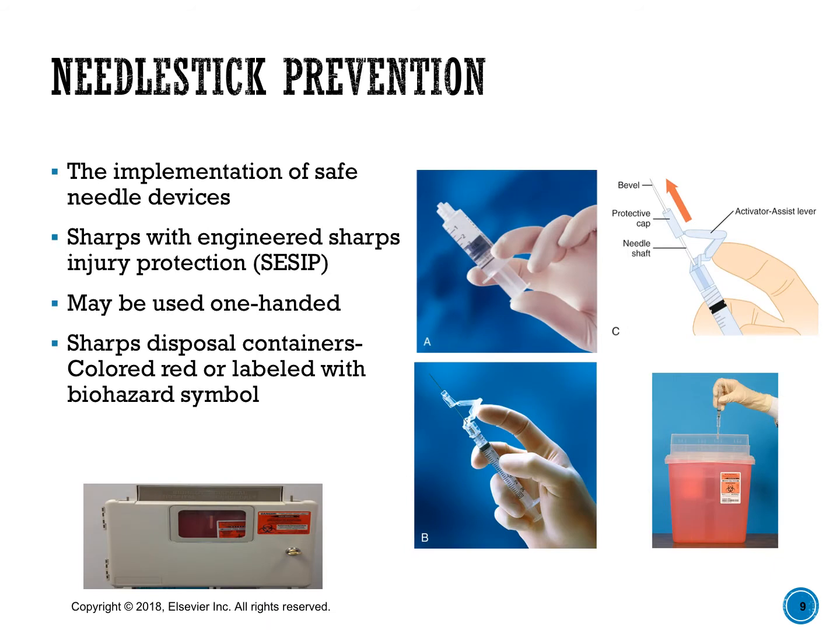So it's also important to cover needle stick prevention. Needle sticks are the most frequent route of exposure to bloodborne pathogens for healthcare workers. So we need to be really careful. Most of them will occur in the patient's room or in the operating room. And they will occur when healthcare workers recap needles or mishandle needles or leave them at the patient's bedside.